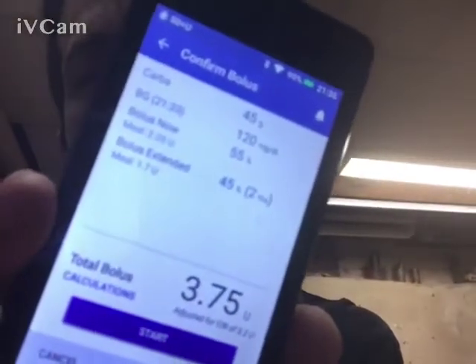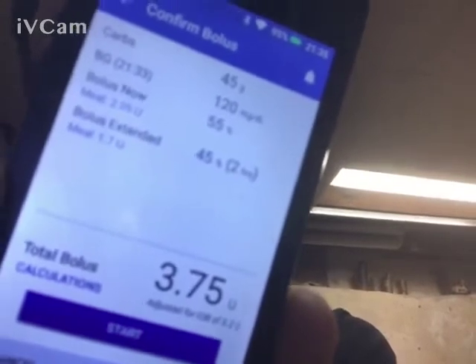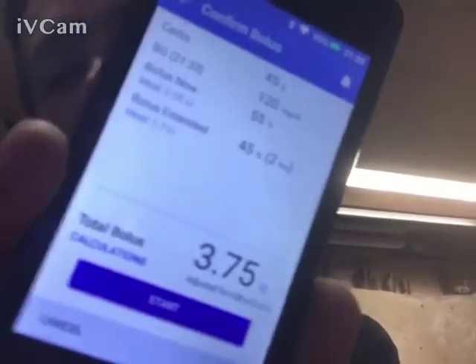Once you hit confirm, you get to that window. It tells you what it is, what it's going to give you right now, what it's going to give you extended over 2 hours, and the total amount on the bottom. And if I hit start, then it would actually start to do that.